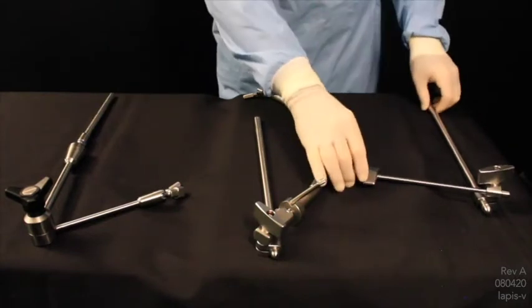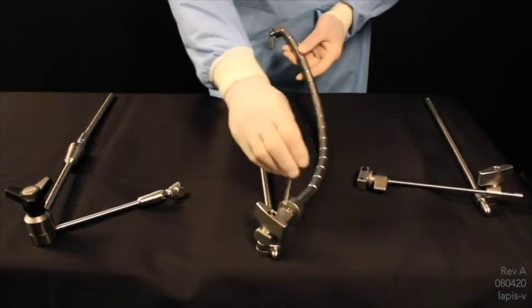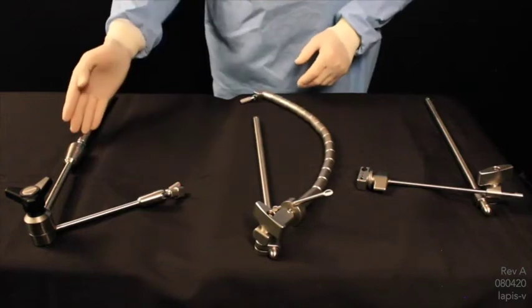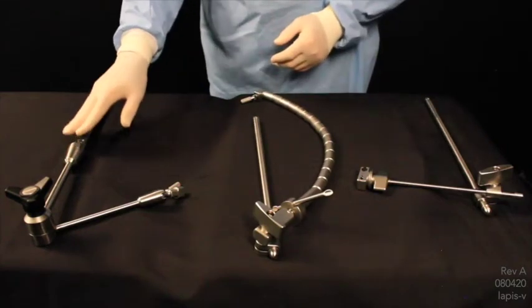Our instrument holder has most rigidity. Our flex arm gives some rigidity that can be adjusted here. It has most flexibility. And then our articulating arm gives both the flexibility and rigidity.